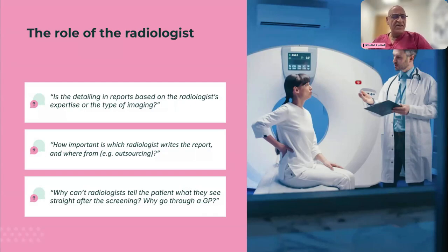There's another question, is there, Lily? Yeah, so I think the other questions here can be summarized in terms of how important is the actual scan image itself versus the radiologist interpretation. Well, just go back to ultrasound. The ultrasound imaging is done on the day by the radiologist. The images don't really mean anything to anybody else because I can take lots of pictures of somebody's abdomen, but it means nothing because it's real-time imaging.